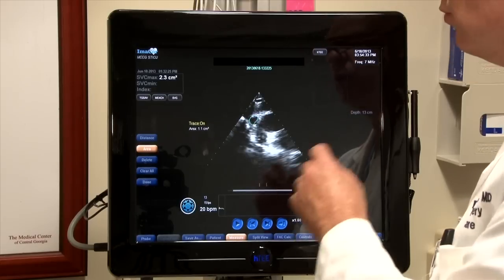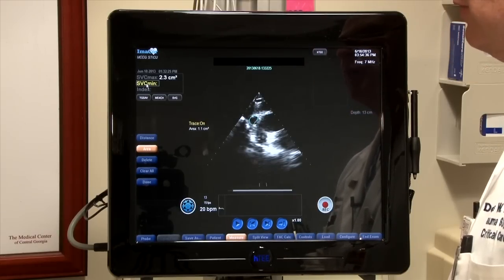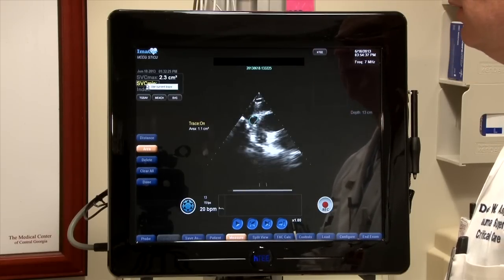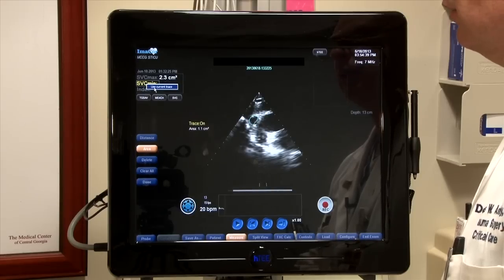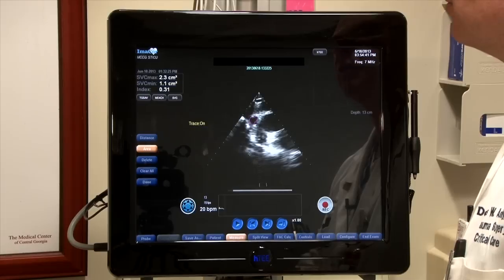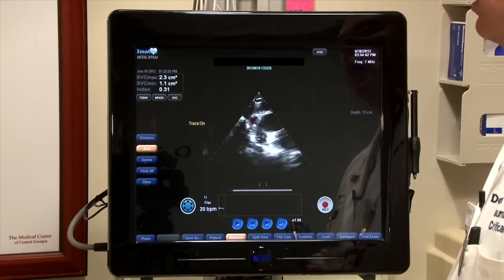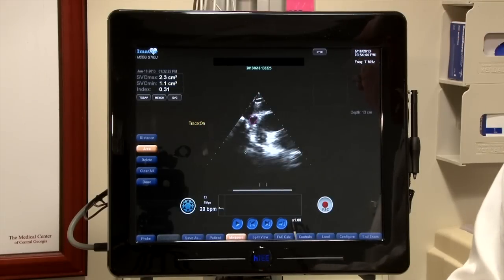You can see it's 1.1 centimeters. I'll come over here and click on SVC minimum, right click, use current tracing, yes — and it calculates the index for me.